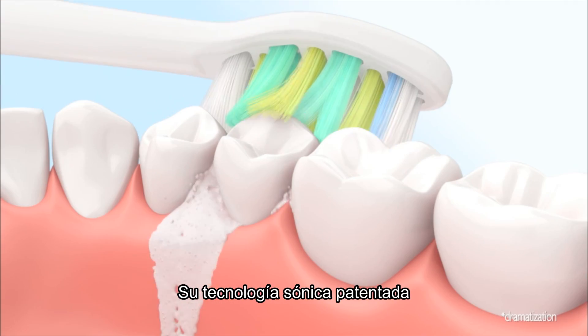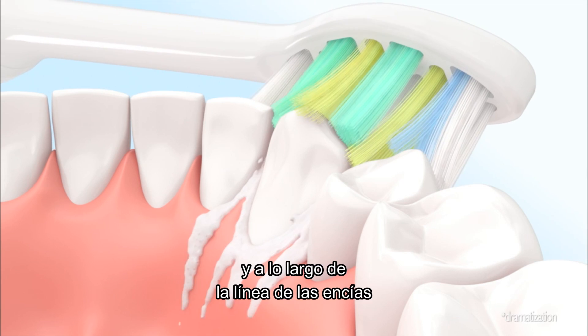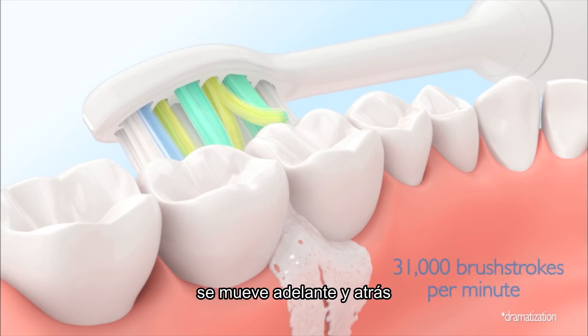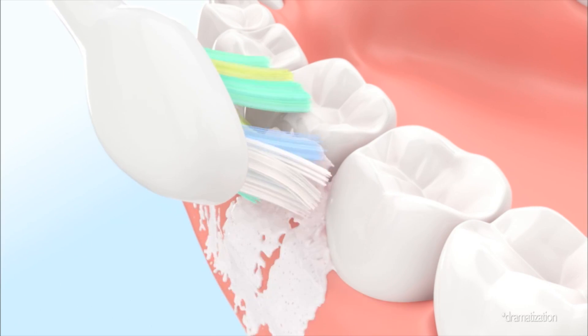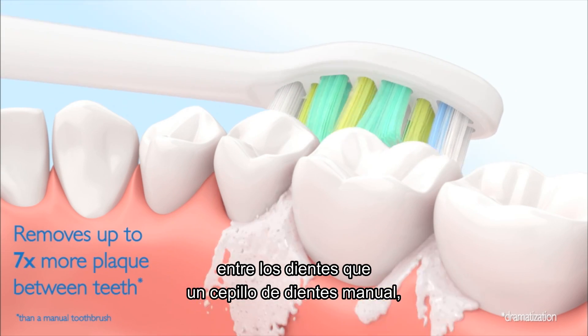Its patented sonic technology creates a dynamic cleaning action that drives fluid deep between teeth and along the gum line, while its unique brush head with extra-long bristles sweeps back and forth reaching further between teeth to where plaque and bacteria flourish, which means it removes up to seven times more plaque between teeth than a manual toothbrush.